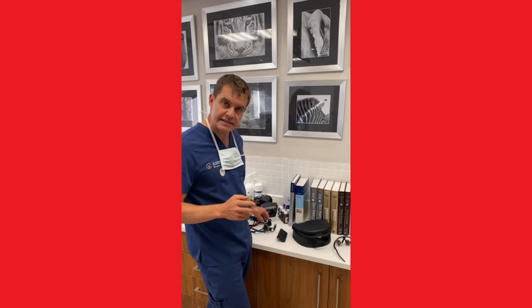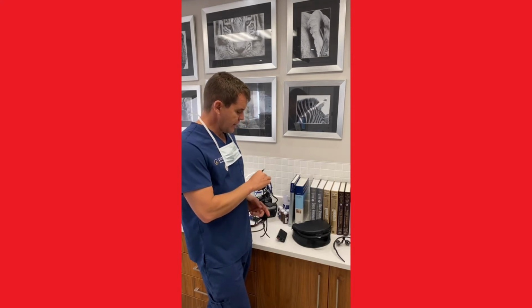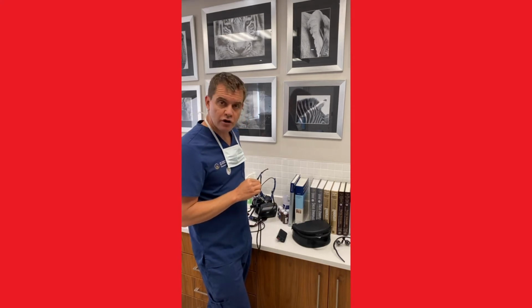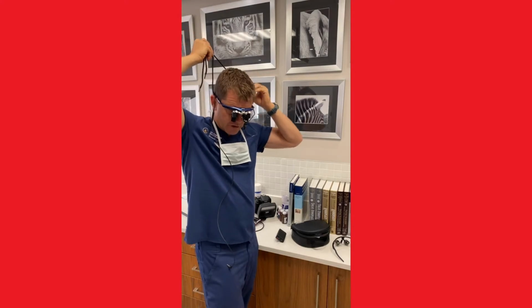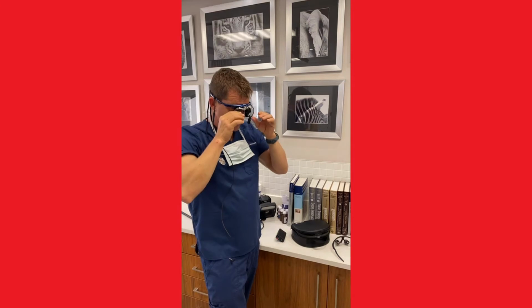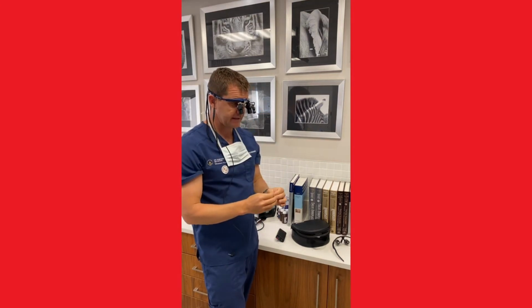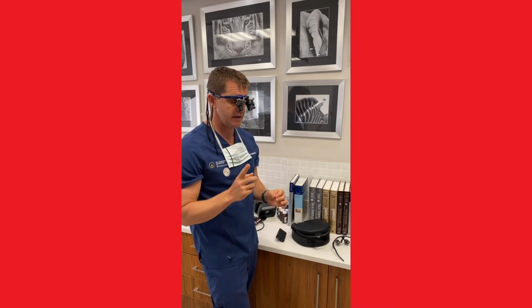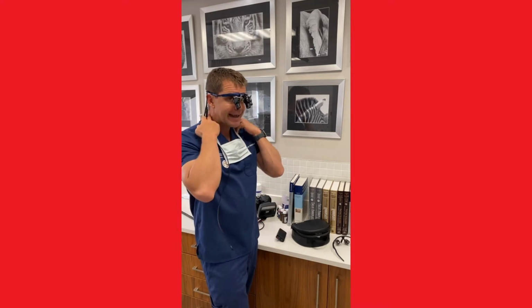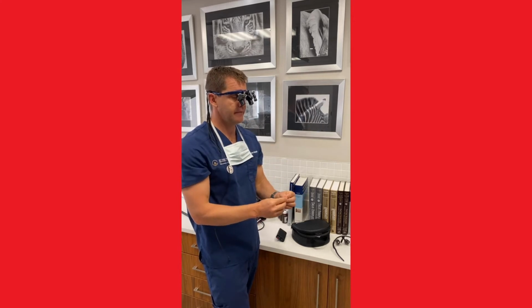Now they do various things. These guys obviously are very specialized in photography stuff, Pentax. So the first time it's a bit cumbersome, you get used to it, etc. Now what happens is you then actually can turn these loops to where you're at. And the single biggest difference for me is my neck is not bent down, okay? So I'm looking forward and operating here, okay?